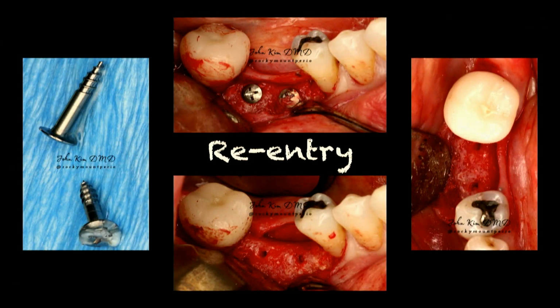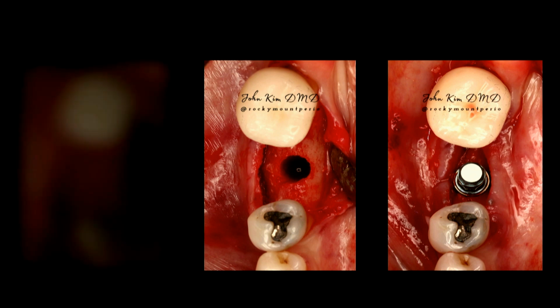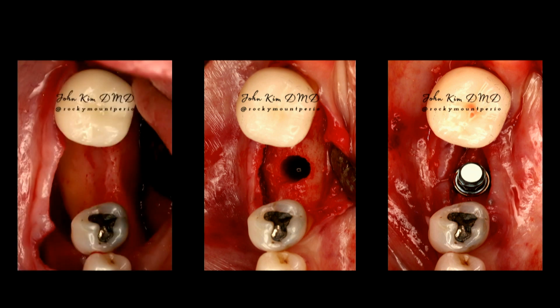here we are at re-entry, removing the hardware. Now, I don't have a crazy amount of bone, but I have just enough that I feel good enough to go ahead and place an implant in good quality bone. And that's where we were to begin with.